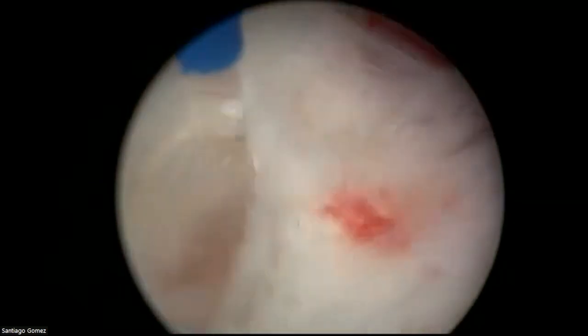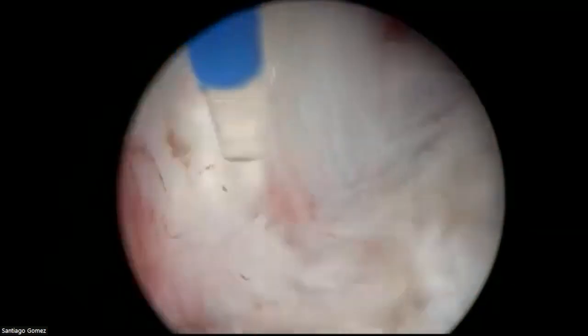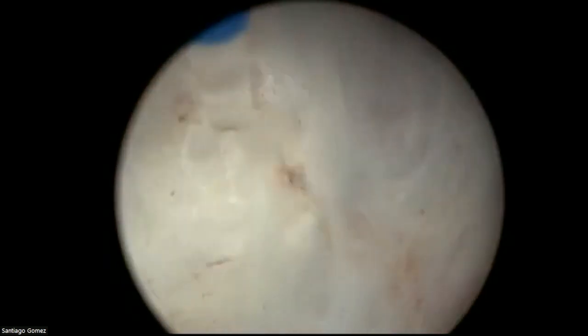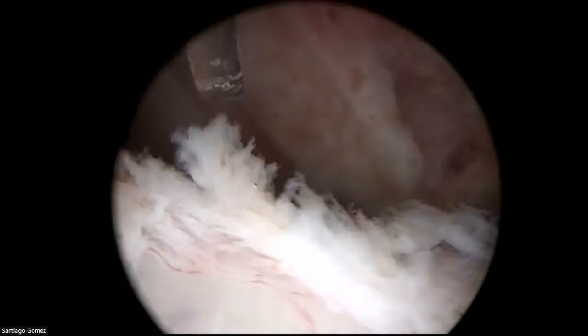And I'm going to do the same on the other side. So if you reflect about it, when we started at the apex posteriorly, we entered one side, we developed the other side, we connected in the middle. Then we did something similar to get towards the anterior parts, to liberate the sphincter. We went from one side, then from the other side, and then we connected in the middle. If we started posteriorly at the apex, here we are starting anteriorly. So the bladder neck, we enter anteriorly. And you see now we have managed to open the bladder neck.